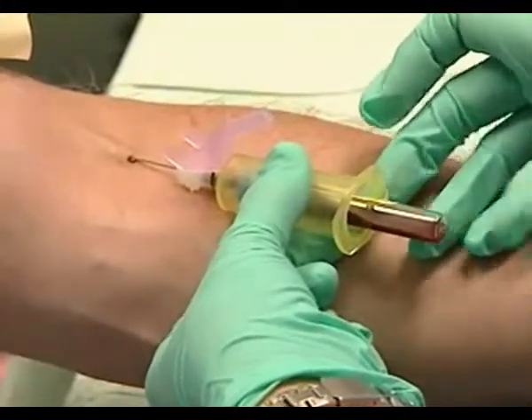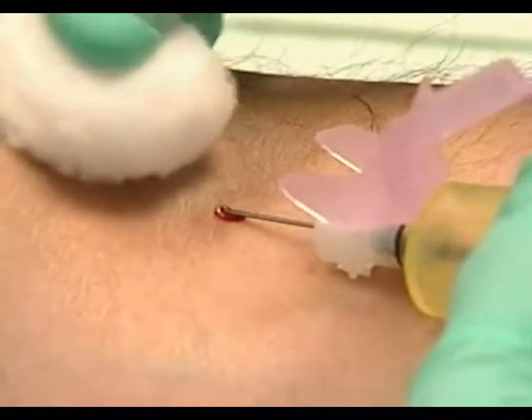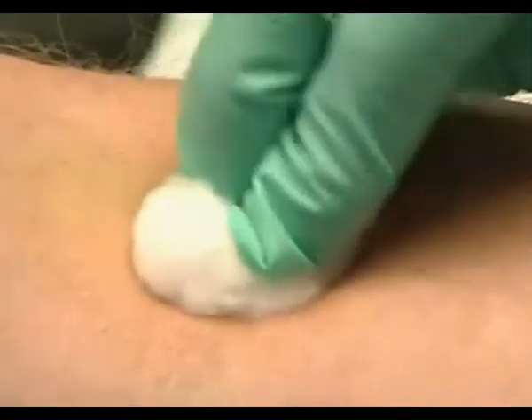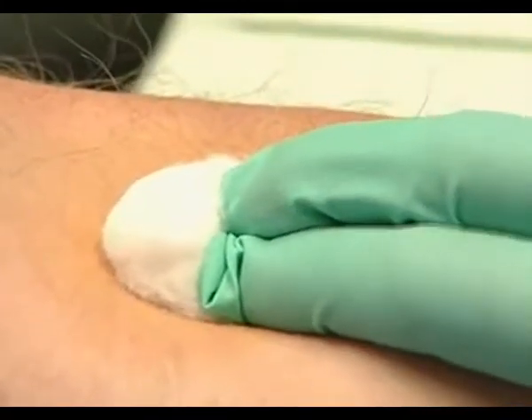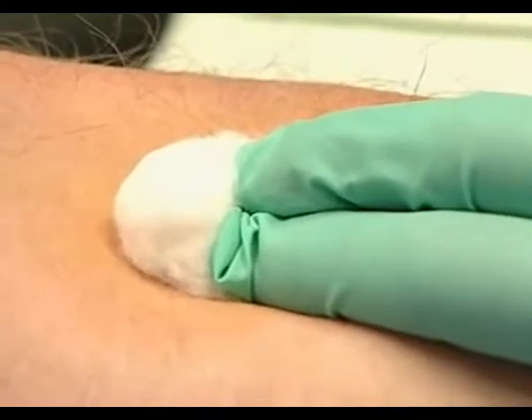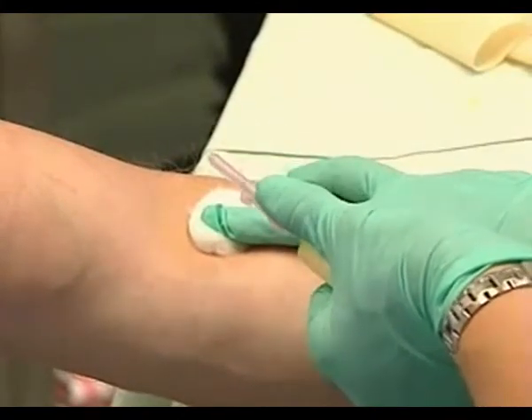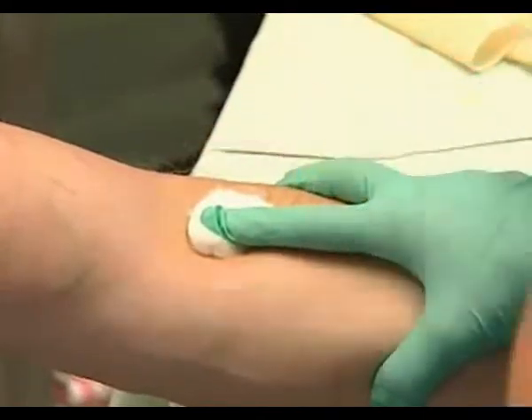As we finish, one pull of the tourniquet. Place the cotton ball above the puncture site, not directly on the needle. Withdraw the needle straight back and roll the cotton gently over the puncture, applying steady pressure. Having the patient bend at the elbow to hold the cotton in place can create unnecessary bruising. Flip the needle guard back into place, protect the puncture, and the sharp goes right into the container.